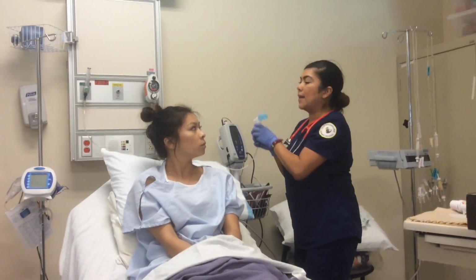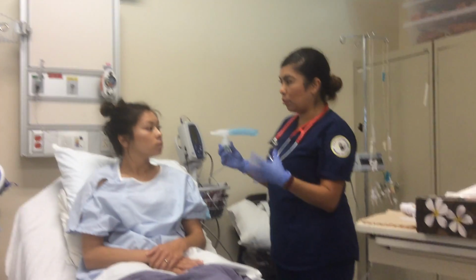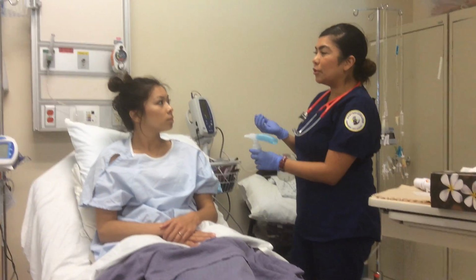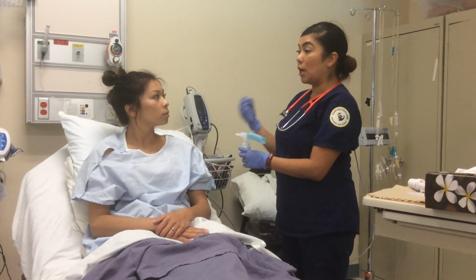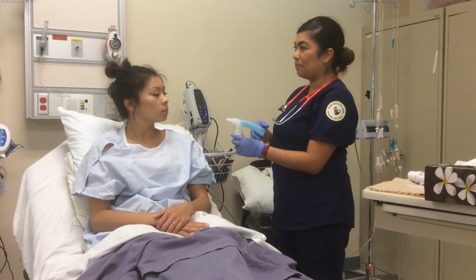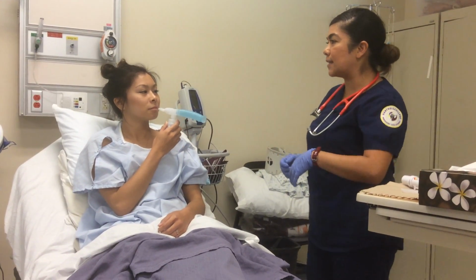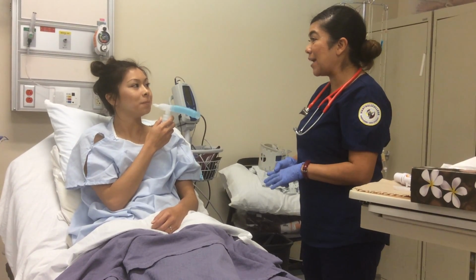I want you to just breathe in regularly, normally through your mouth. You would seal your lips around the mouthpiece, okay, and just breathe in. And after maybe like 5 or 6 breaths, if you could just go ahead and hold your breath in a little bit, and then just exhale out, okay? So I'll just leave you with this. And this medication usually takes anywhere from 5 to 15 minutes, okay?